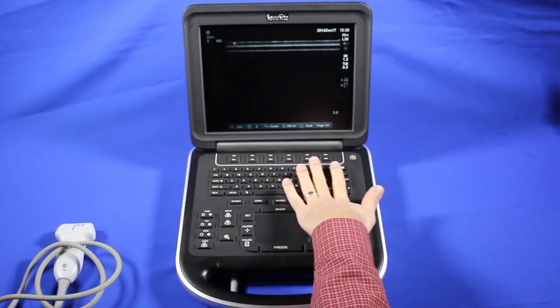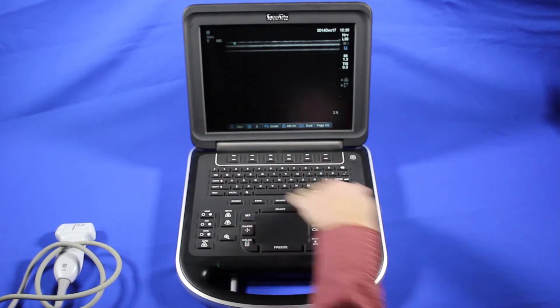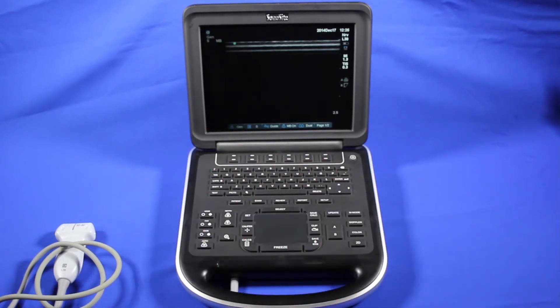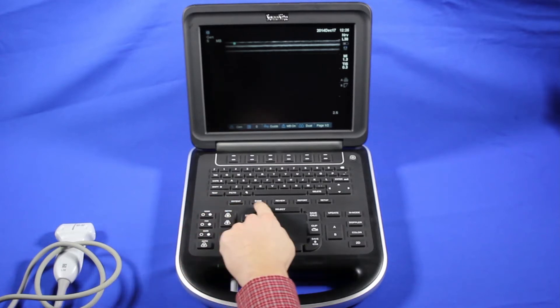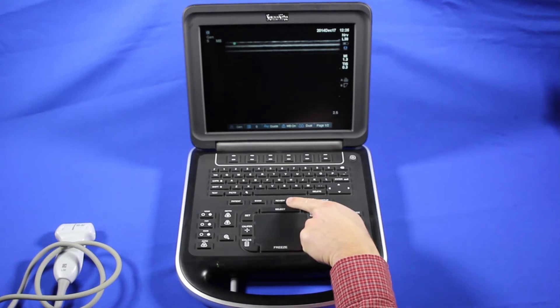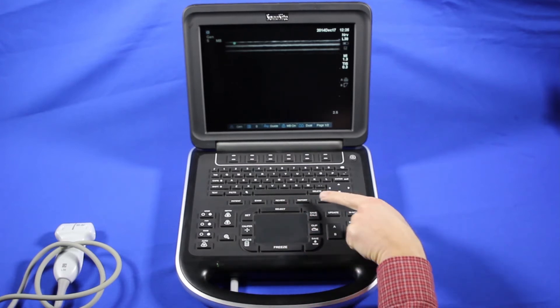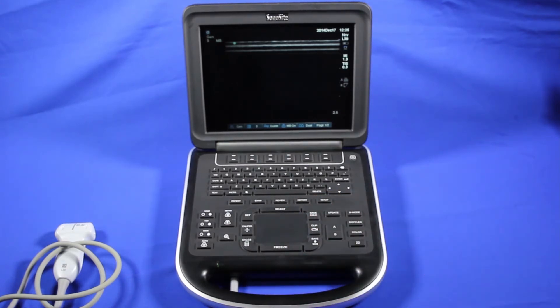First, we have a standard keyboard here. Above it, we have some soft keys, which I'll get to later. Coming down, we have our patient info key, exam — which allows you to choose the exam preset — review for reviewing images, report for reviewing the report, and setup for setting up the system. I'll go through all of these buttons more in depth as we go through the training.